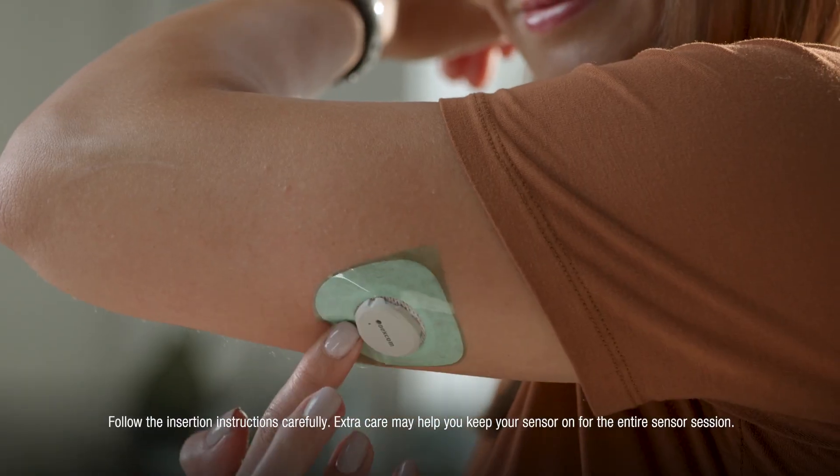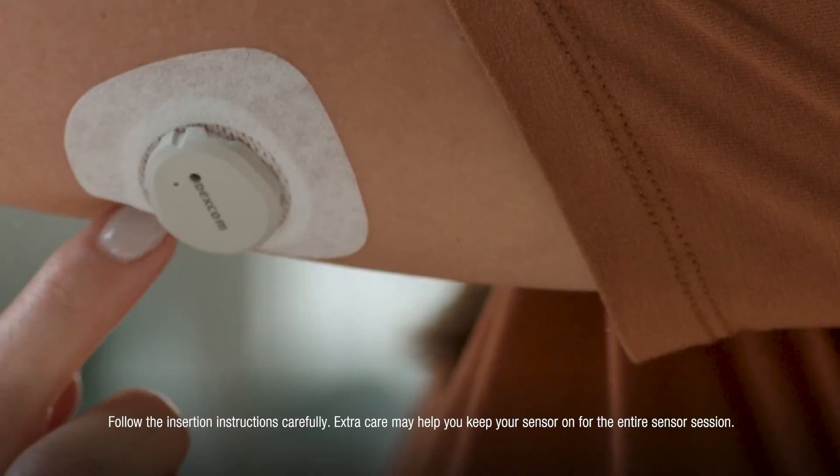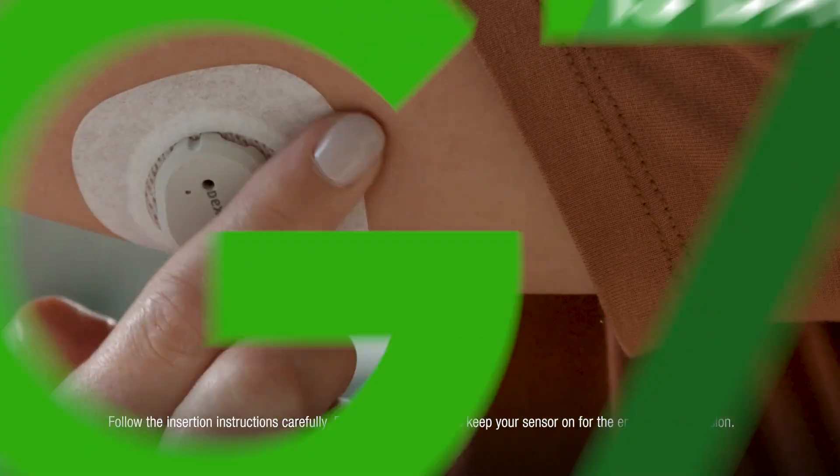Rub around the overpatch, then use the tab to peel off the liner. Rub around the overpatch again. Your sensor and overpatch are now complete.